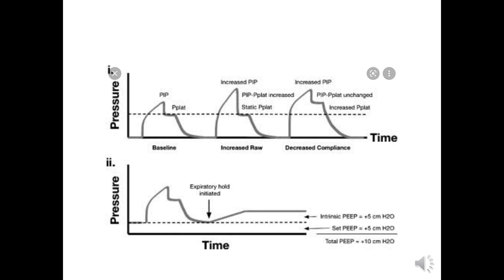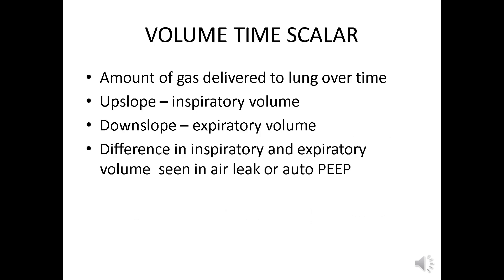In this graph the baseline PEEP is set, and at the end of expiration we perform an end expiratory hold. After the hold we determine the intrinsic or auto-PEEP developed within the lungs, shown here as 5. So the patient has a total PEEP of 10.